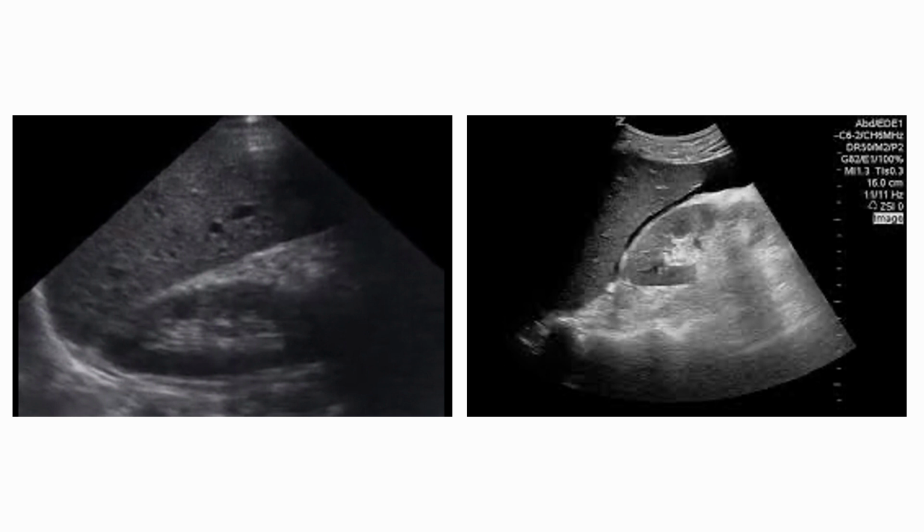On the right, we see an abnormal finding. We see a dark black pouch at the very tip of the liver, and then extending between the liver and the kidney. And this is indicative of free fluid. And again, in the setting of trauma, we're going to assume that this free fluid is possibly blood.